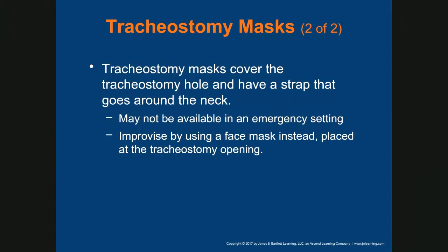Tracheostomy masks cover the tracheostomy hole and have a strap that goes around the neck. They may not be available in an emergency setting. Improvise by using a face mask instead, placed at the tracheostomy opening.